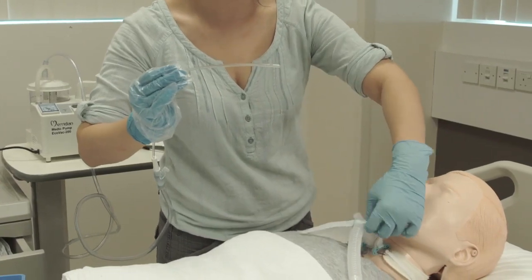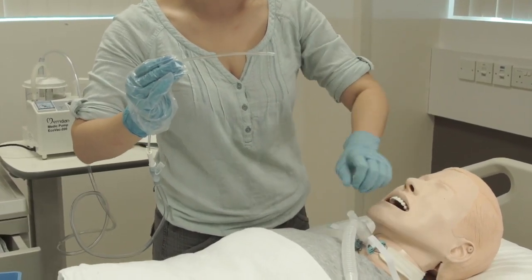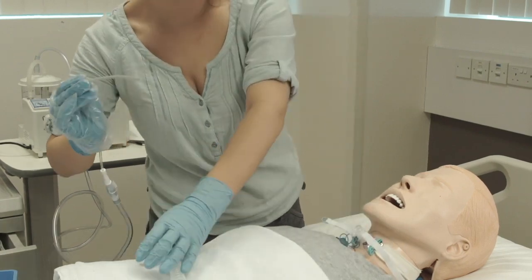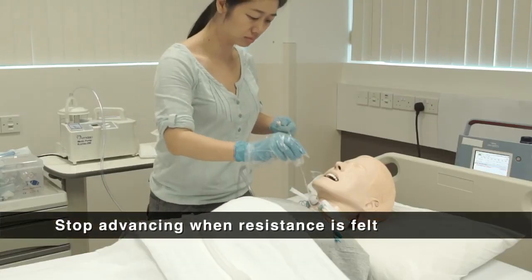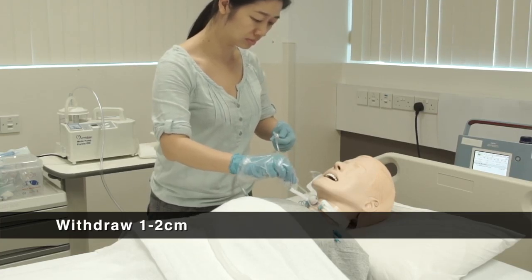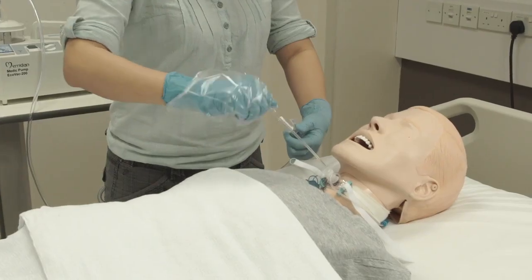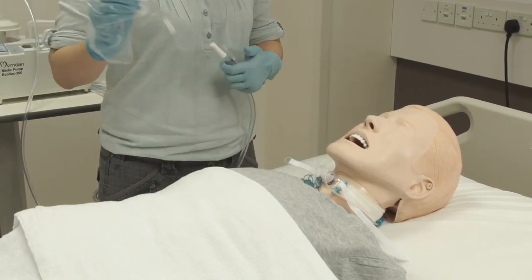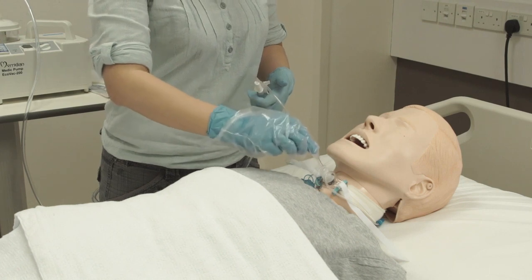Disconnect the ventilator tube with your non-sterile hand. Insert the catheter until resistance is felt, then withdraw 1 to 2 cm. Apply suction and remove the catheter slowly in a rotating motion. Repeat the suction process until secretion is cleared.